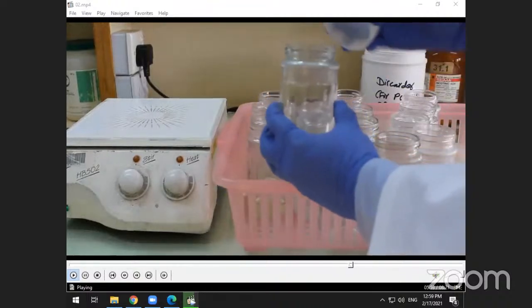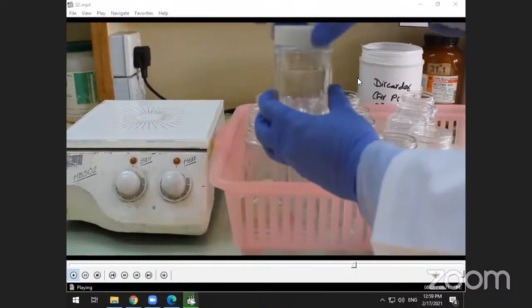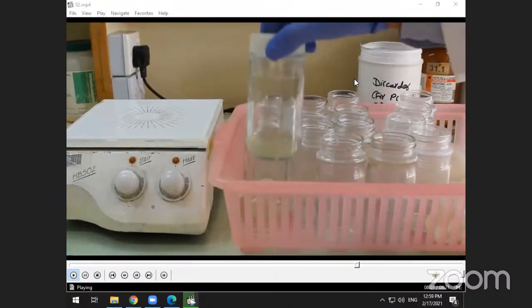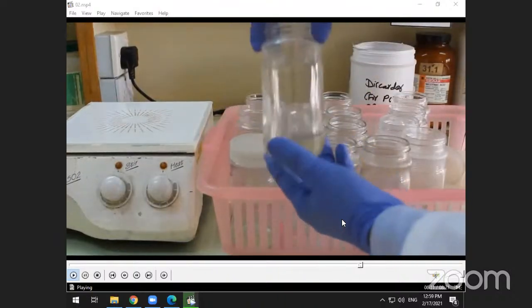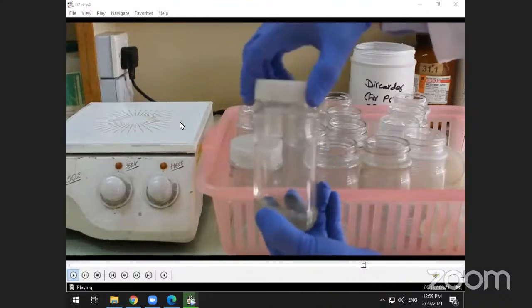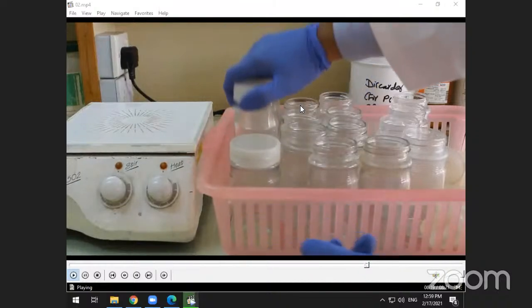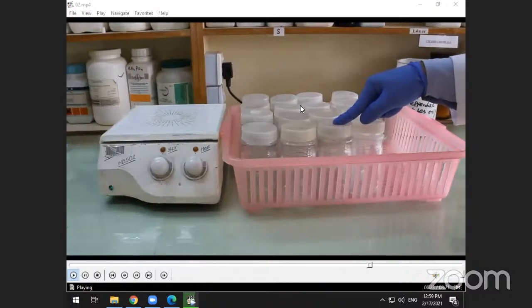Close the caps of the jars carefully and tight, and proceed to the autoclave.